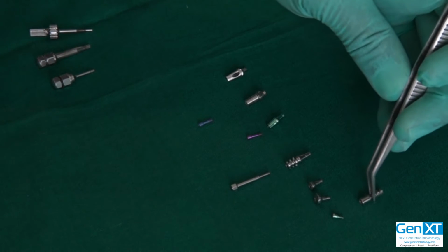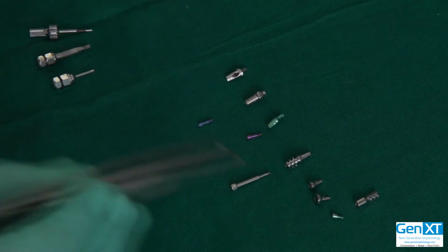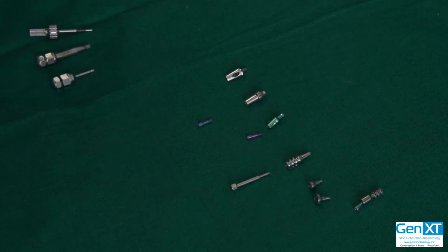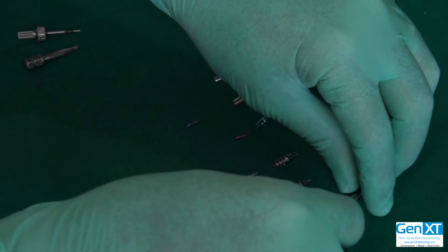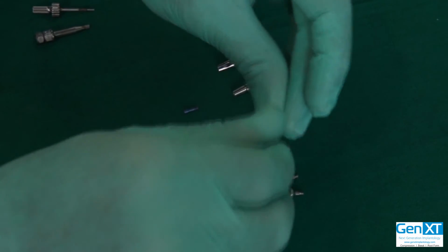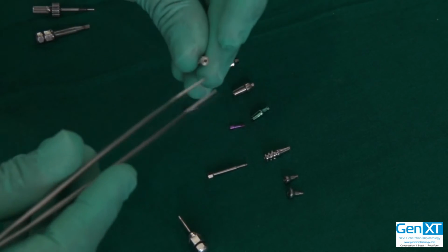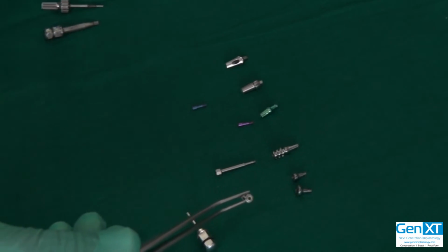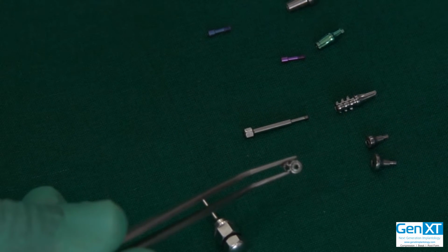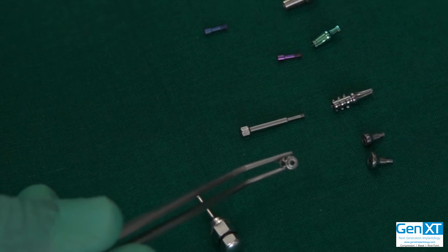Now initially when you have placed the implant, you have on top of it the cover screw. Since we have the chance here and we have some time, I would like to show you. Now if you see, I don't know if you can focus it nicely so you can appreciate something here. Can you see that the cover screw is a lesser diameter than the diameter of the analog? It is also this way in the implant.